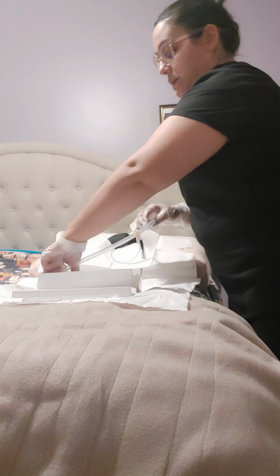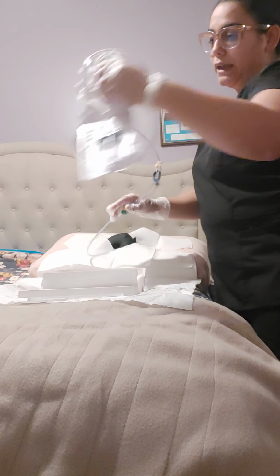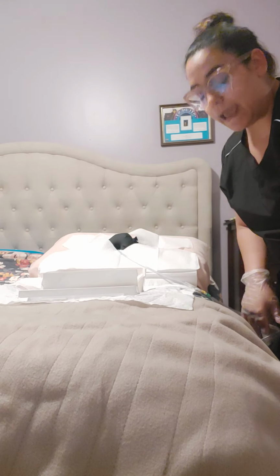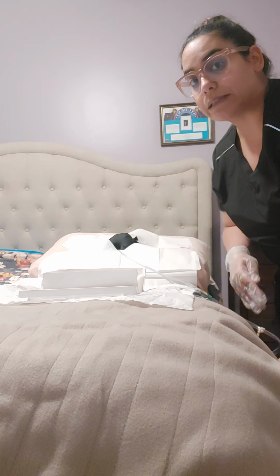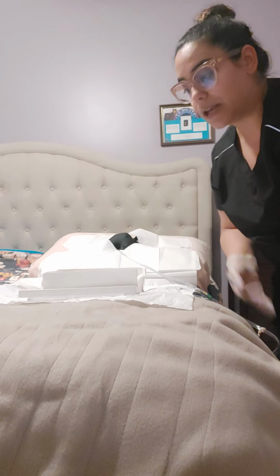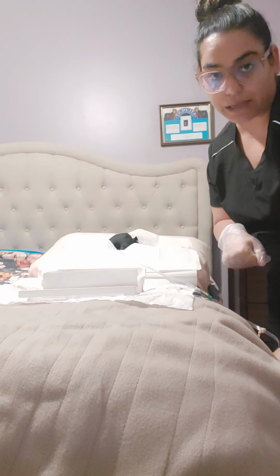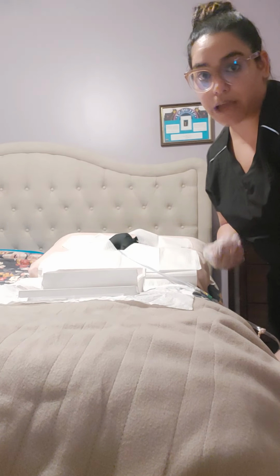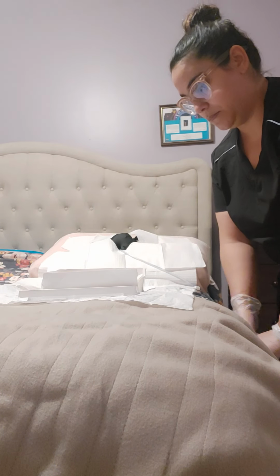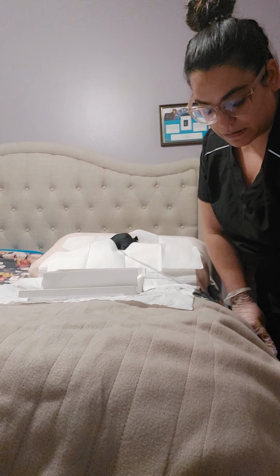And then I would make sure that my bag is clamped, which it was, and I would hang my bag below the bladder of the patient and on the side of the bed, but making sure that it is not on any area that is movable on the bed, like the side rails, just because, once again, the movement of you pulling up the side rails, if your bag is on there, can cause it to pull out the catheter and cause more complications and damage to the patient. So that is there on the side.